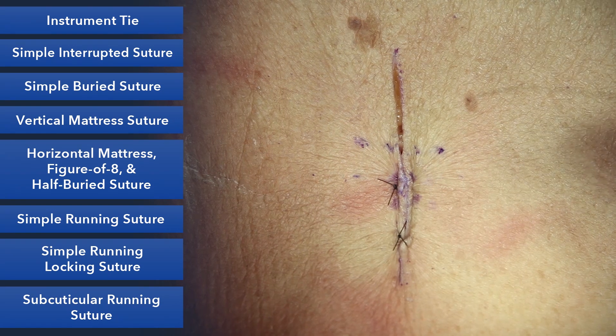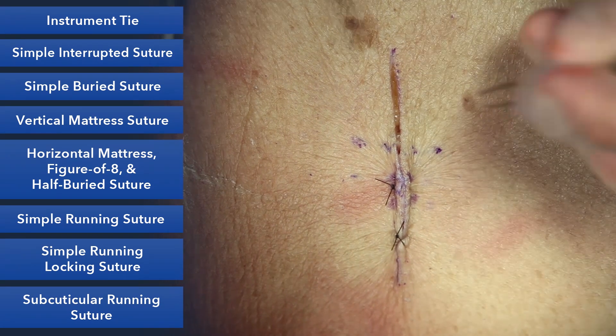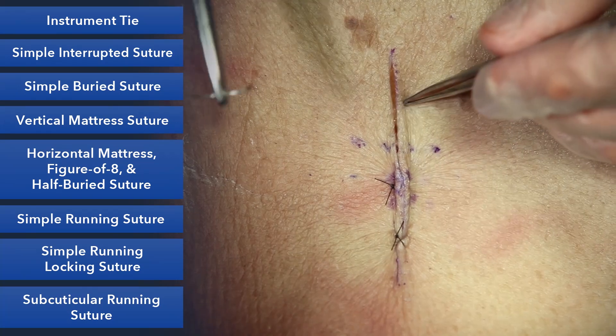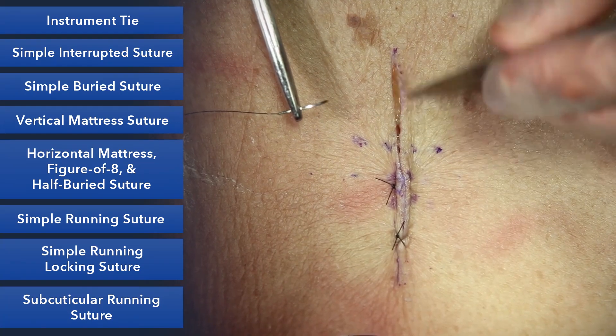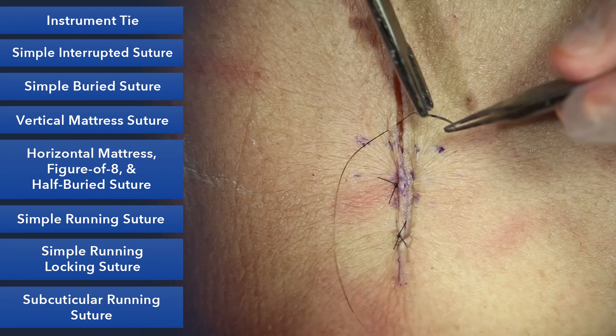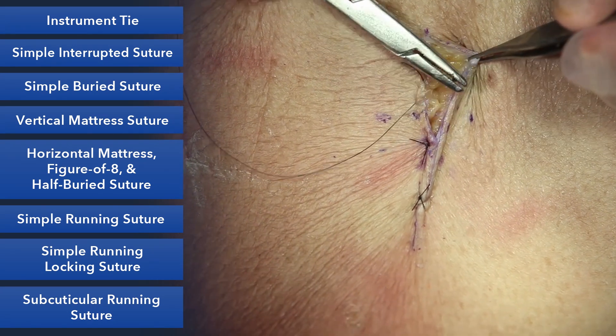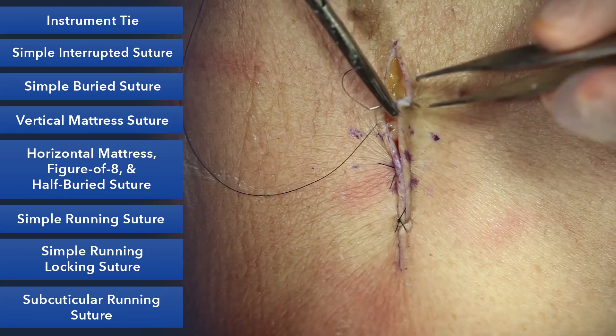The final variant of the horizontal mattress is called a half-buried mattress, and we use this a lot in plastic surgery. If there's an area where you don't want suture holes, you can actually start your horizontal mattress on one side, then on the opposite side stay within the dermis in a horizontal, subcuticular fashion.